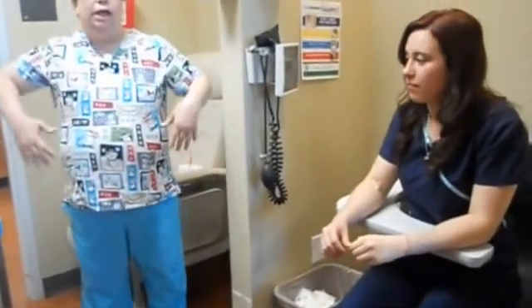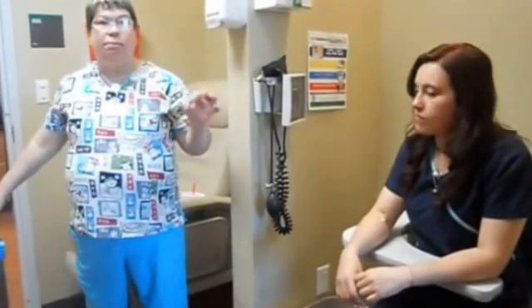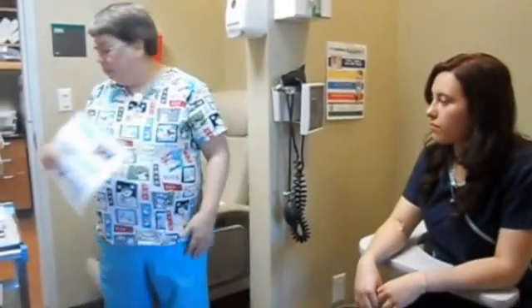Heel sticks. Heel sticks are done on neonates less than 3 months, or if they're preemies, they can be less than 6 months. When you do a heel stick on an infant, you will be collecting blood in what's called a microtainer, and there are pictures of a microtainer in your slides. The red is comparable to our red top, the green is a green top, and the purple is a purple top for CBC. Green is chemistries and red is for whatever.